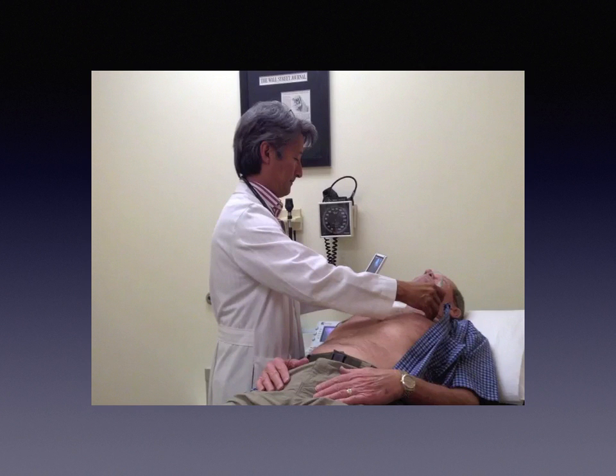So now we're going to talk about the bases of the lung, because the lung will weep fluid once it has had high pressures over time. So the presence of pleural effusions raises our sensitivity for acute decompensated CHF and represents a syndrome that has occurred over days to weeks, as opposed to flash pulmonary edema, which can cause comets without effusions. So remembering that NYHA class 3 patients who have orthopnea and dyspnea on exertion may not have comets on presentation, but usually have pleural effusions, as you'll see.